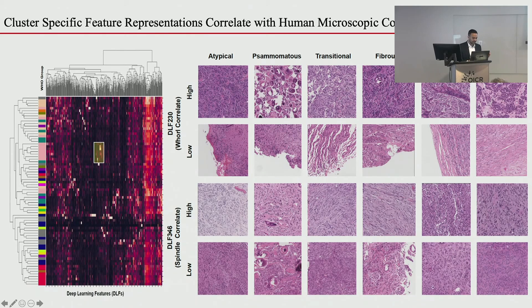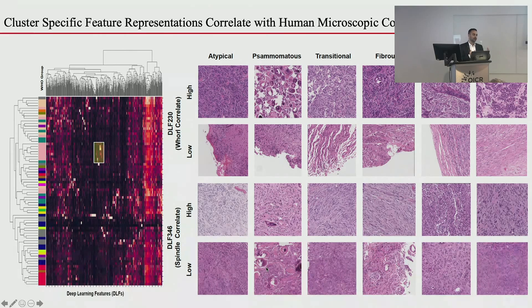Conversely, feature 346, also found in the meningioma cluster, shows a spindle morphology. Going through the same groups of images but looking for high feature 346, you find spindle morphology across the classes, while in the low-346 tiles you see nice whorls. So we now have control over understanding how the neural network is making at least some of these decisions — two complementary features capturing different morphological aspects of meningiomas.